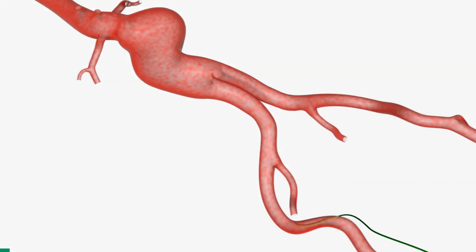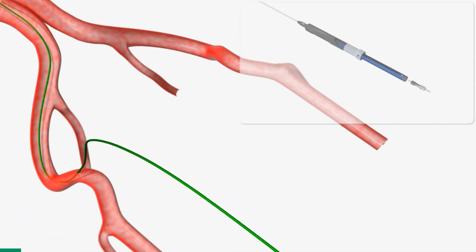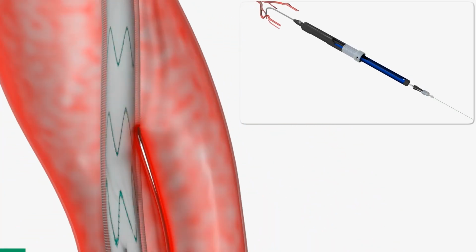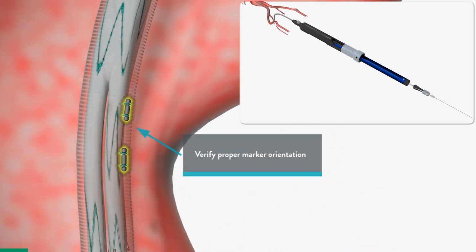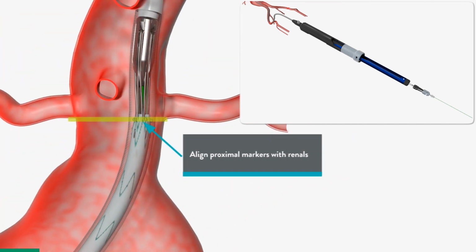After the patient is properly positioned and appropriate access is achieved, introduce a 0.035-inch guide wire into the artery and advance it to the descending thoracic aorta. Once the guide wire is in position, slowly advance the main bifurcated stent graft delivery system into the artery over the guide wire. Note the position of the flush port, as it will indicate the approximate radial orientation of the contralateral gate. Continue advancing the sheath until the delivery system tip is near the deployment site in the aorta.